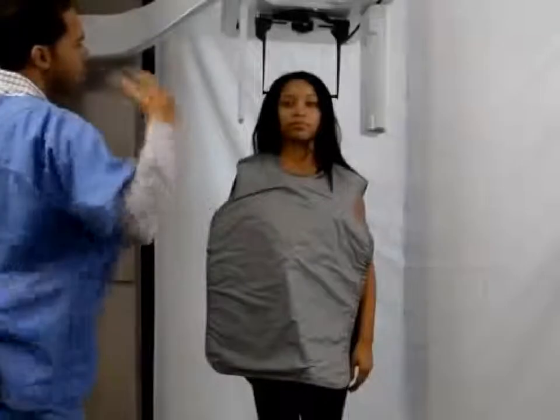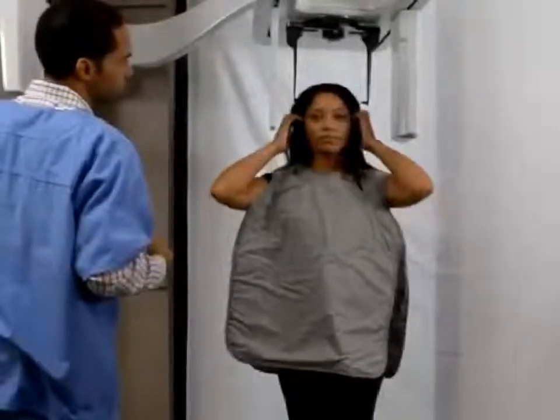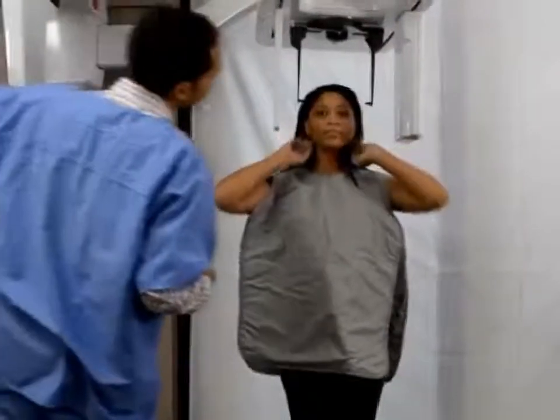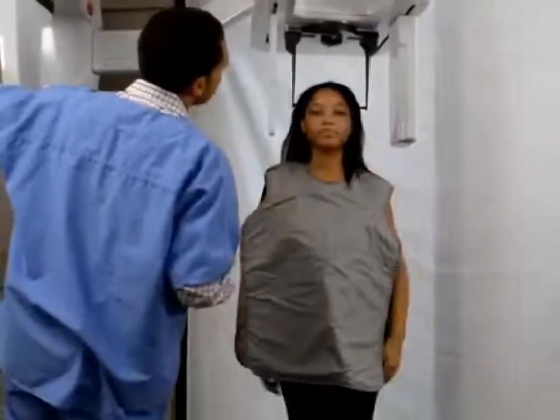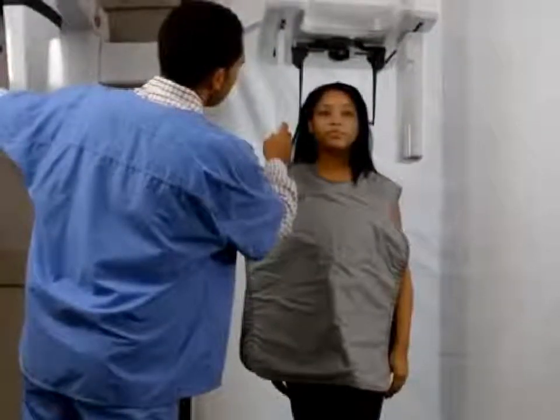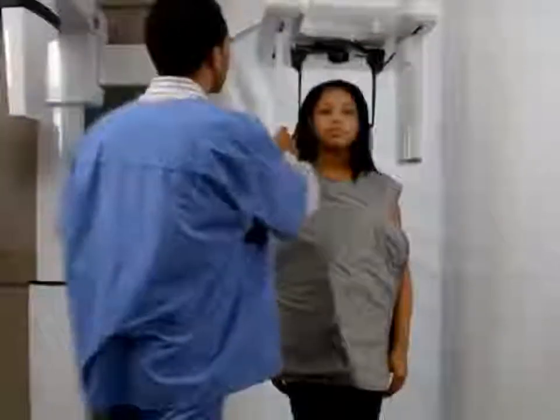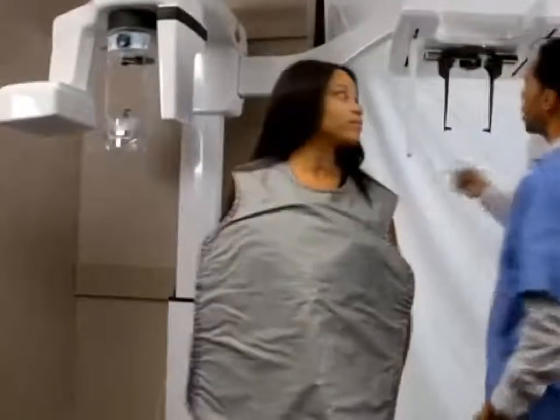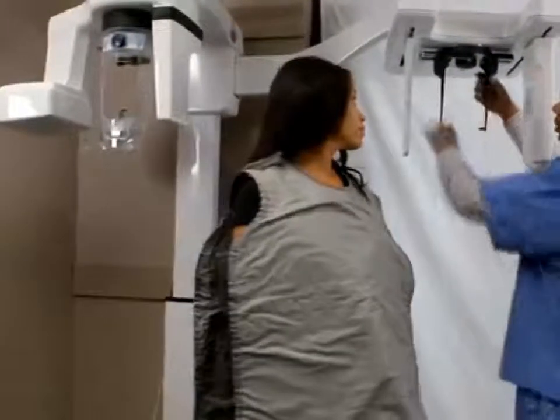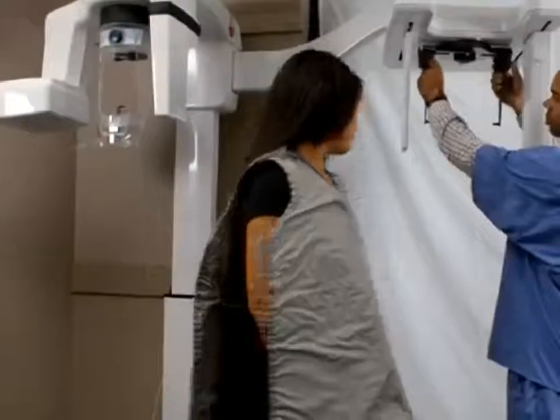To adjust the machine to the patient's height, use the Height Adjustment button and move the machine to the correct height. If the patient is tall, have the patient sit on a stool and then adjust the machine accordingly. After the machine is at the correct height, open the head clamps and instruct the patient to step into the machine.